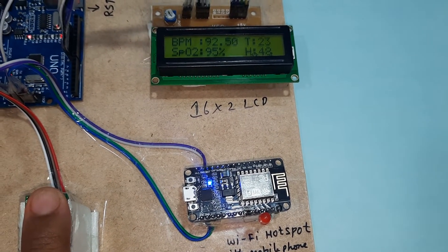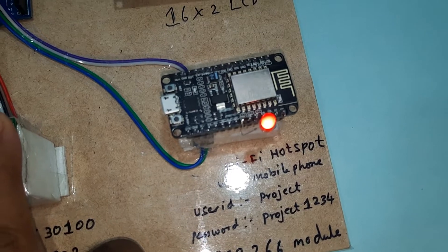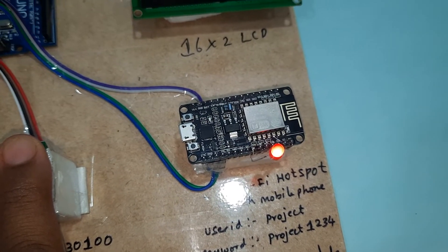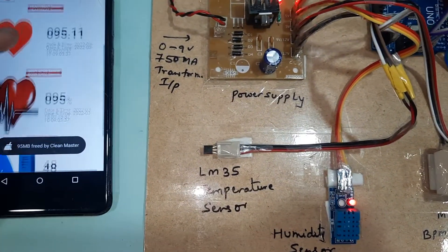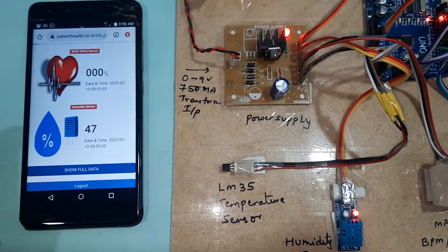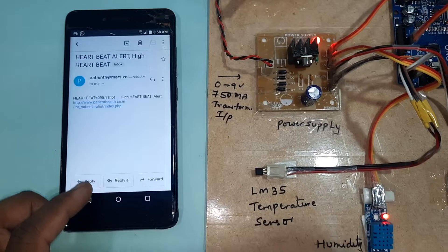SPO2 readings are showing values like 96, 95, 92. The LED lights up when hotspot data is being sent, then closes. On the monitor we can observe readings around 94-95. Whenever the heartbeat or SPO2 rises above the set threshold of 95, an alert is triggered.